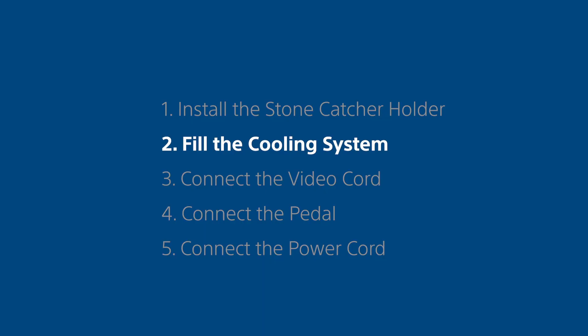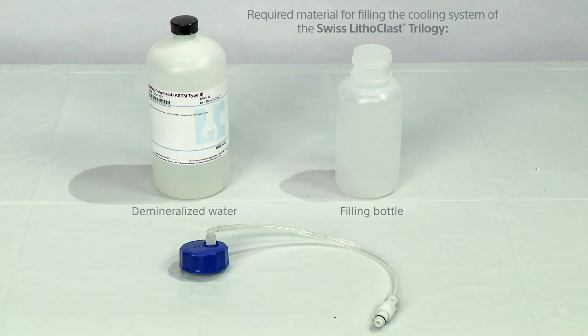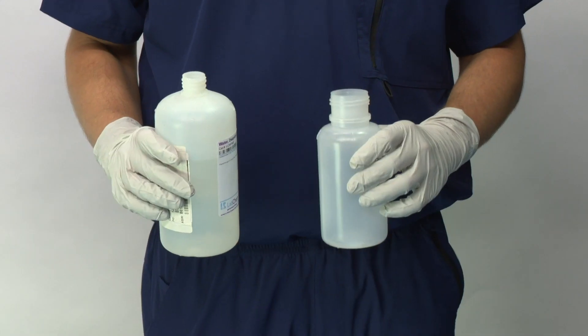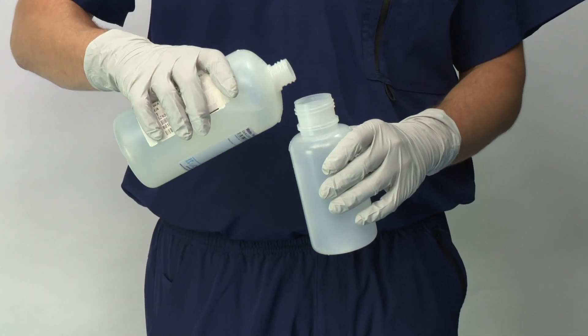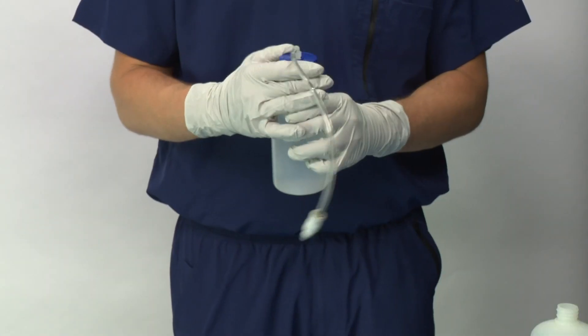Step 2. Fill the cooling system. Fill the filling bottle with demineralized water and close tightly. Connect the tube to the filling bottle.